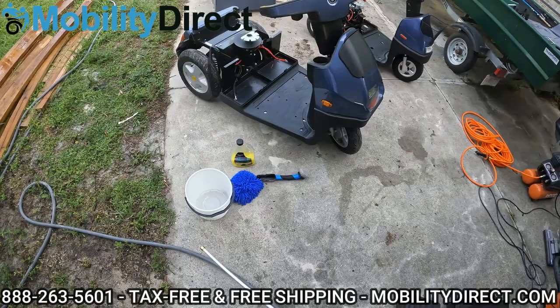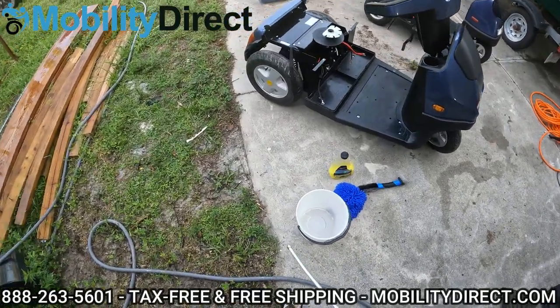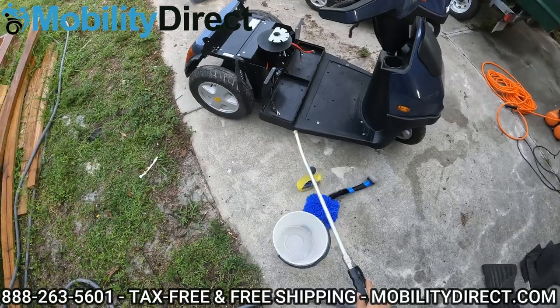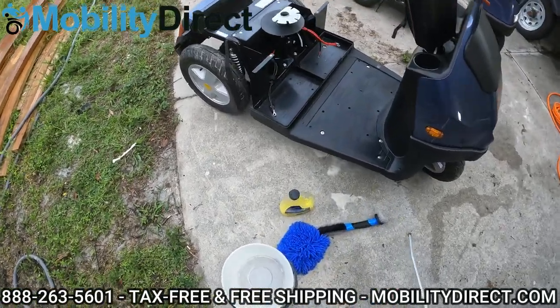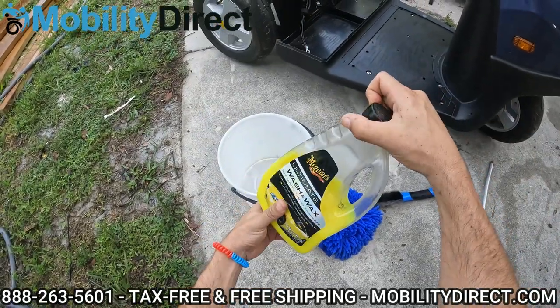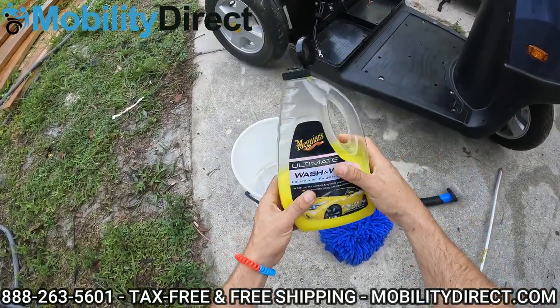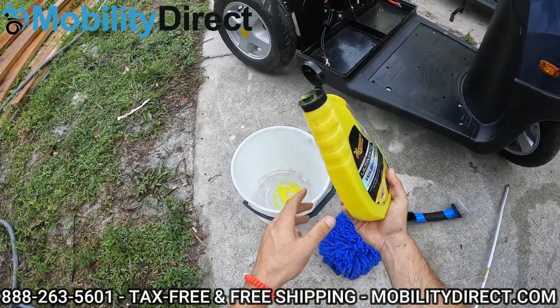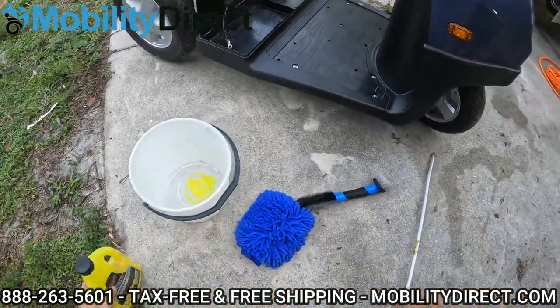We've vacuumed it out a second time after air compressing it, because the air compressor sprayed around a lot of sand and it did get in some of the battery cradle areas. So just to be extra proactive, we did that. I've got some wash and wax formula here — you can use any kind of car wash formula. You really don't even need soap, but if you want to get a nice shine out of it, I recommend using a little bit of car wash soap.